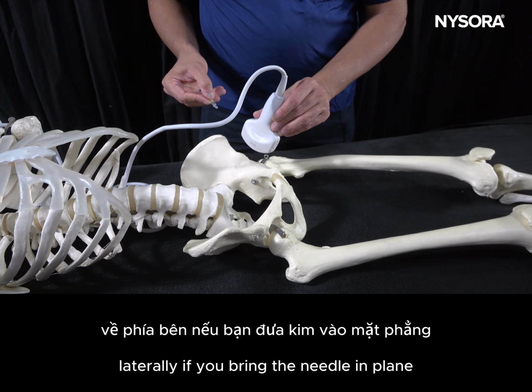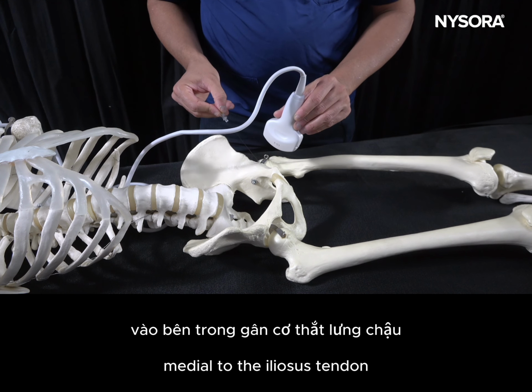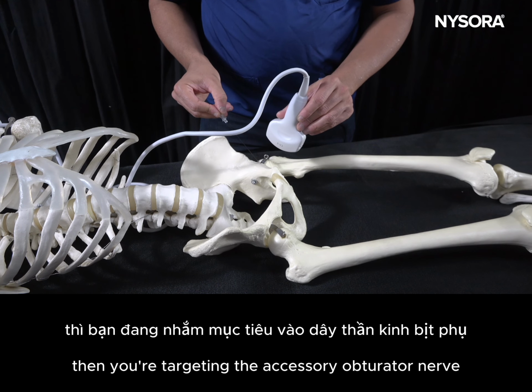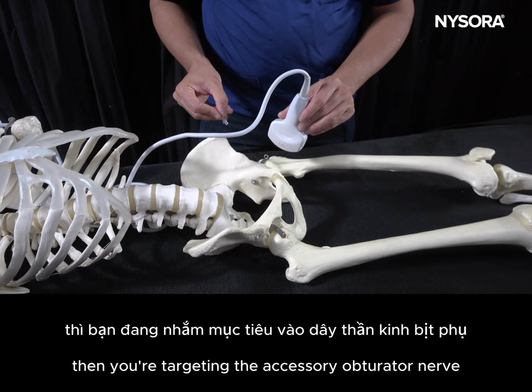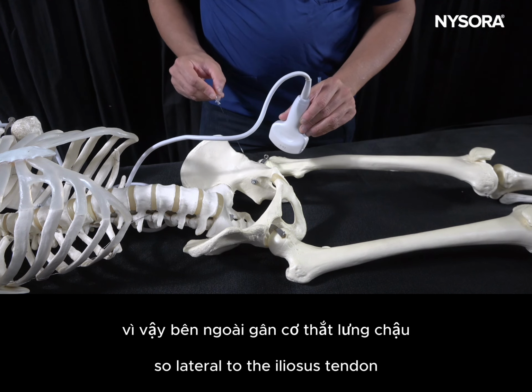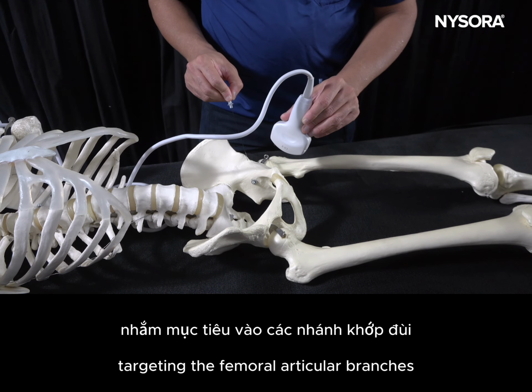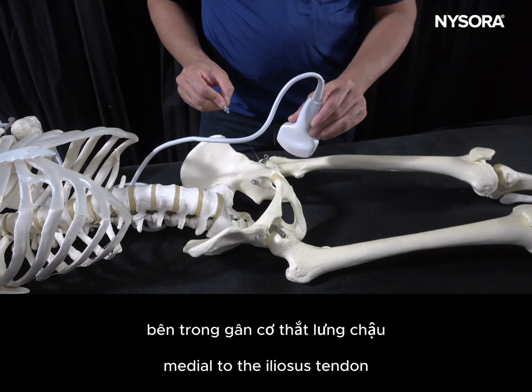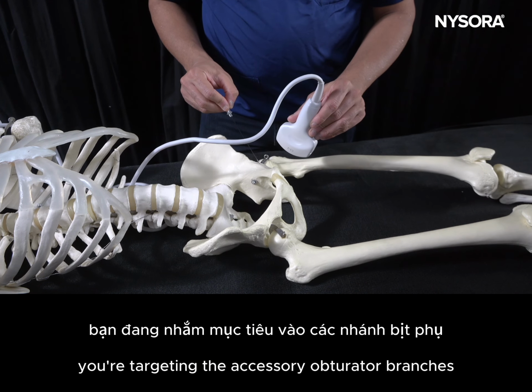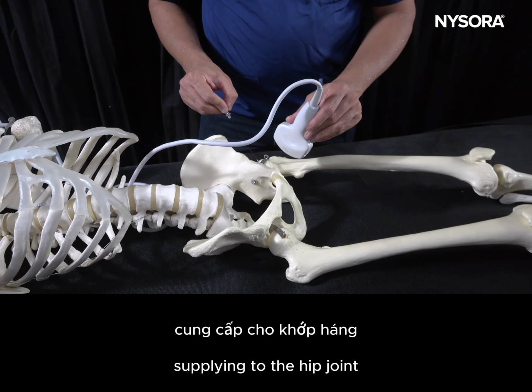If you bring the needle in plane and park the needle medial to the iliopsoas tendon, then you're targeting the accessory obturator nerve branches that supply the hip joint. So lateral to the iliopsoas tendon, you are targeting the femoral articular branches. Medial to the iliopsoas tendon, you're targeting the accessory obturator branches supplying the hip joint.